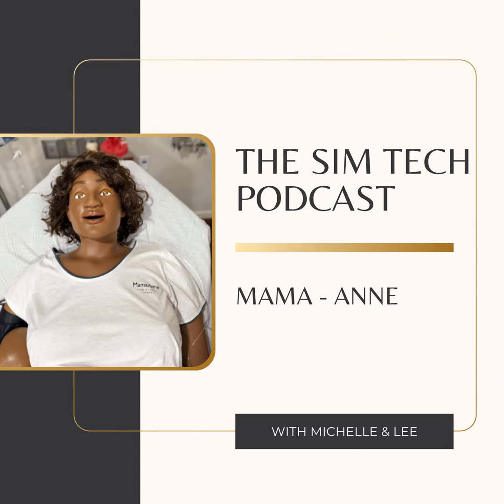She does have seizures as well, so for those of you watching the video, I'll just pop some seizures on so you can see tonic-clonic seizures. Quite useful for preeclampsia scenarios that you might be running, to add to the fidelity. Okay, and you can pop a high seizure on as well, so it's quite realistic to add to your scenarios.